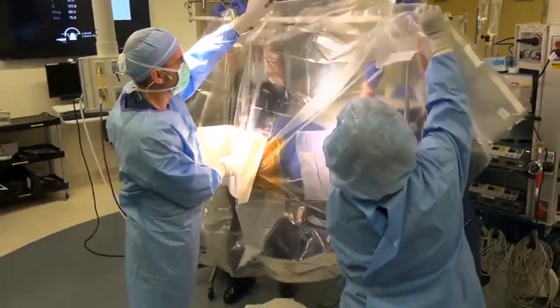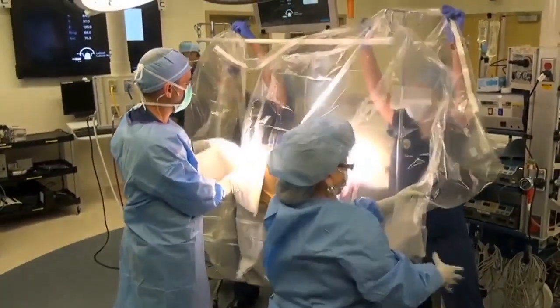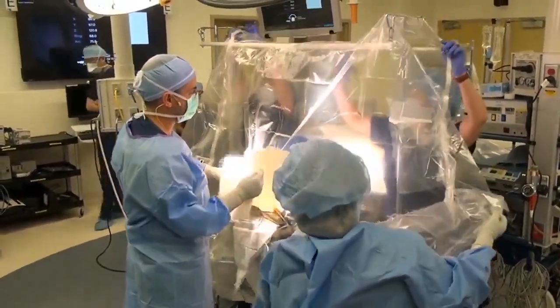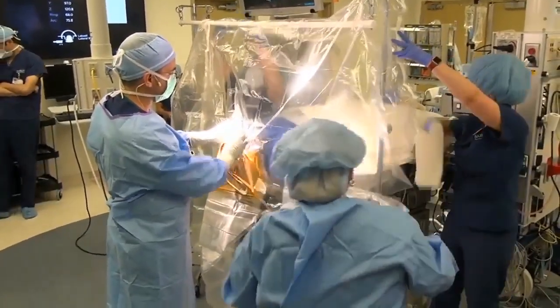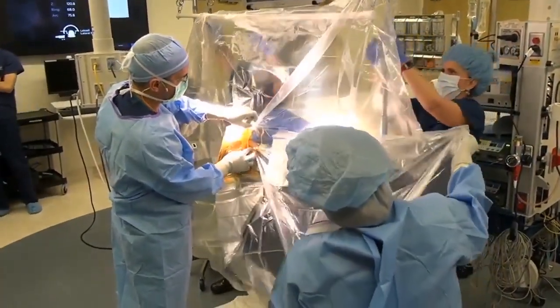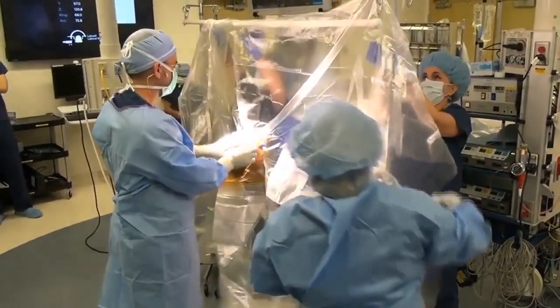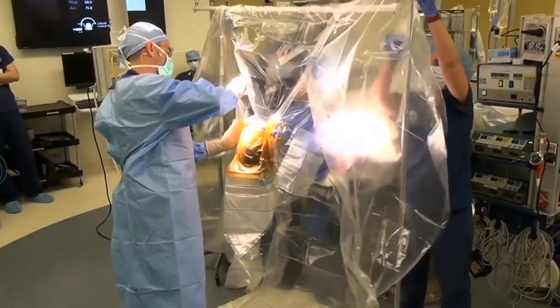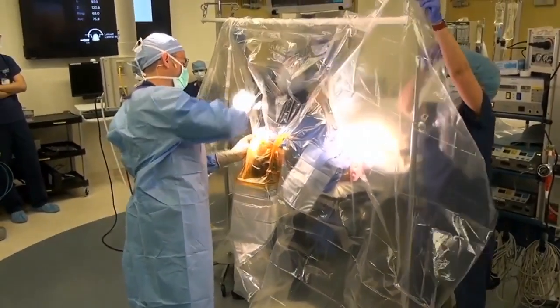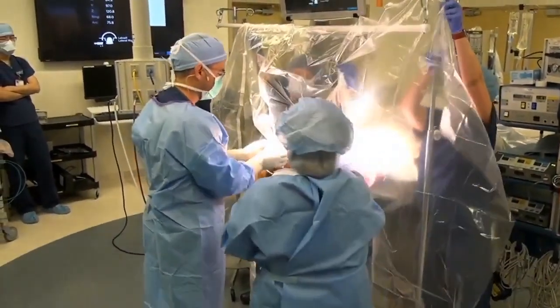All right, we're draping our patient now. And this style of draping is very similar to what you would see in an awake surgery. Although the patient would not be flat, the patient's back would be slightly up to facilitate breathing. And that's one of the features I like about this, that the patient's still in the flat position just like they were for their MRI before the day of surgery.